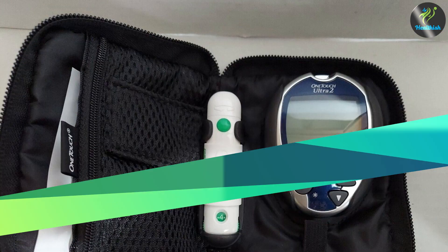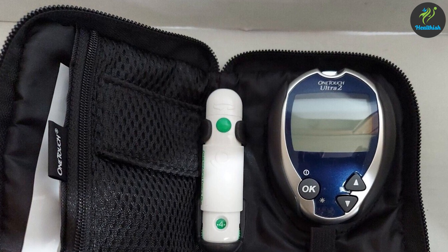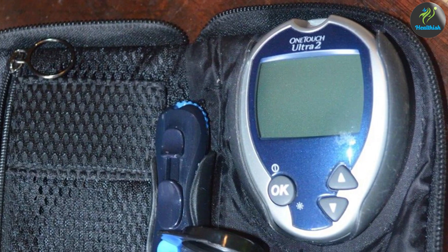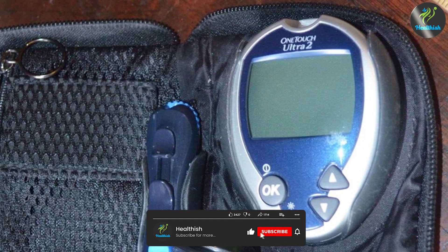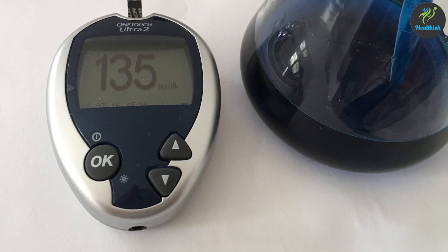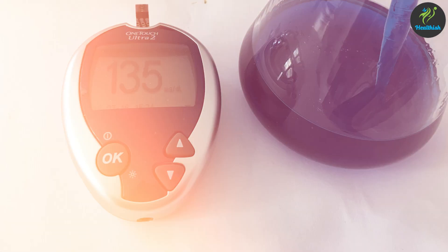The OneTouch Ultra 2 blood glucose monitoring system offers a user-friendly experience with accurate blood glucose readings. Its ease of use, memory function, and additional features make it a popular choice among individuals managing diabetes. However, it's always advisable to consult with your healthcare provider and consider your specific needs before selecting a blood glucose monitoring system.